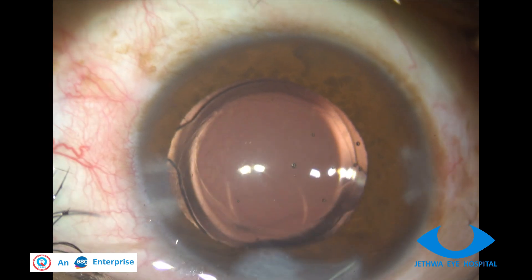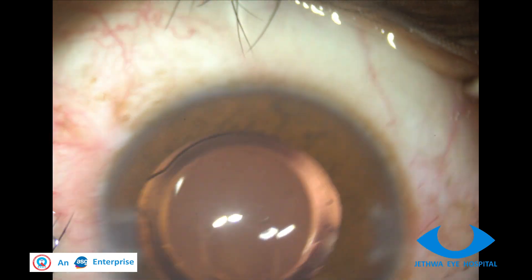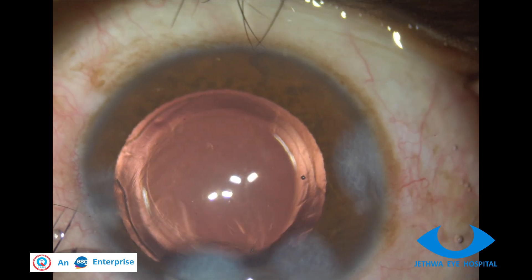If vitreous in the AC is found, it is better to stain it with triamcinolone and perform vitrectomy.